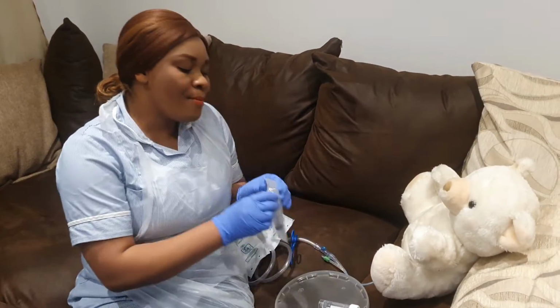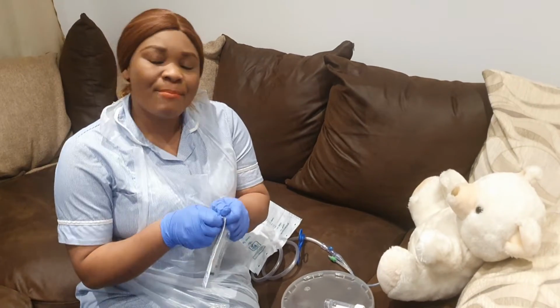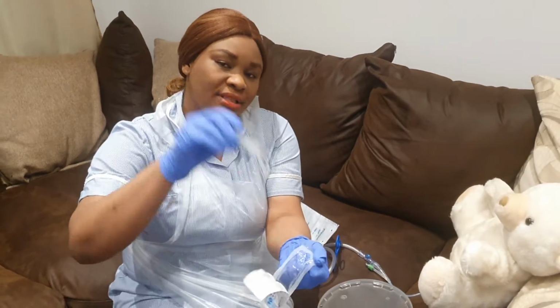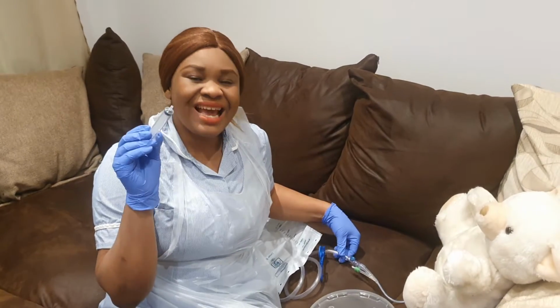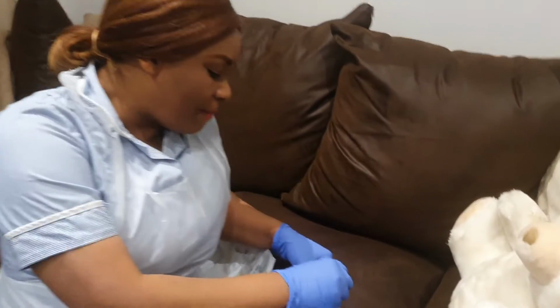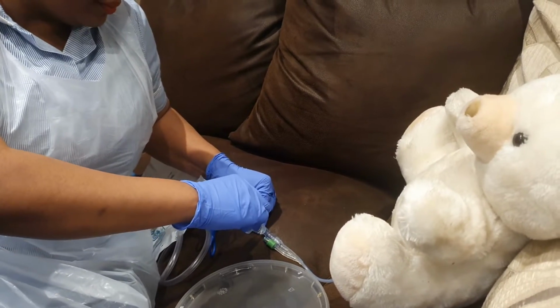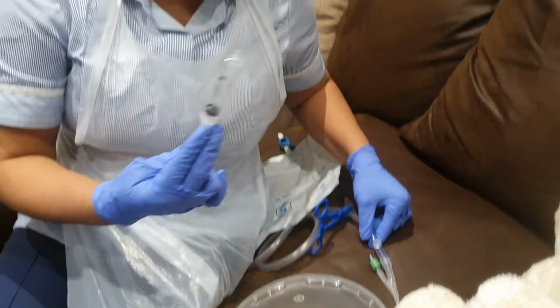So I'll open my syringe, making sure that my hand does not touch the tip of the syringe. So open your syringe just the way I've opened it. Pick up the syringe. Then apply the syringe at the center of the sampling pod. So I'm going to be applying the syringe at the center of the sampling pod, and I'm going to withdraw 10 mils. So guys, assume I've withdrawn 10 mils of urine.